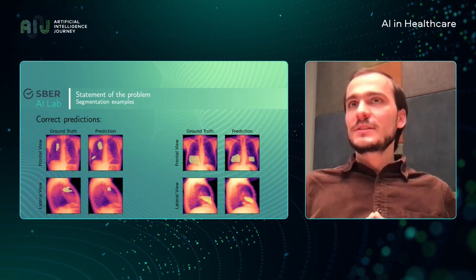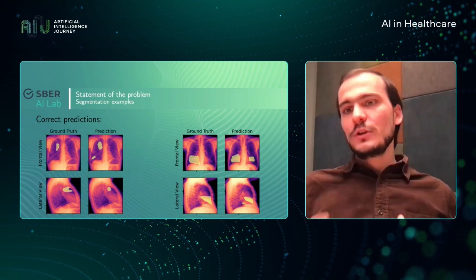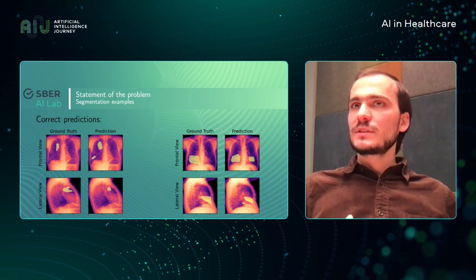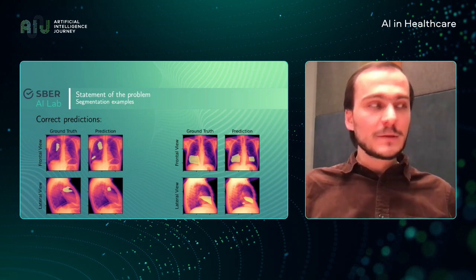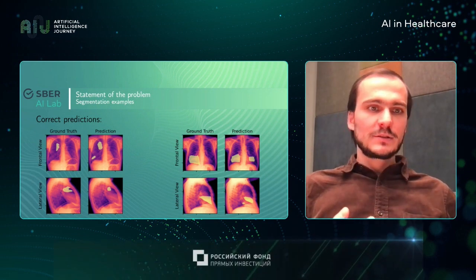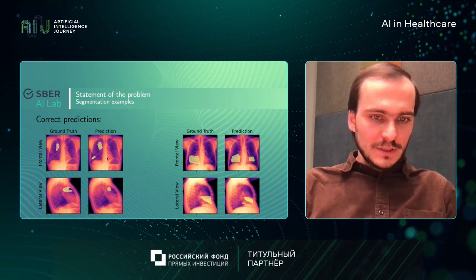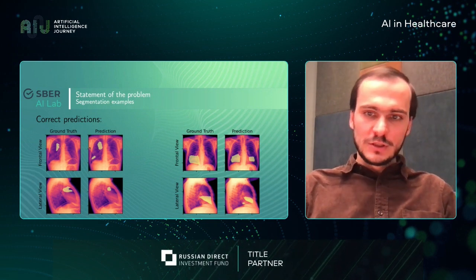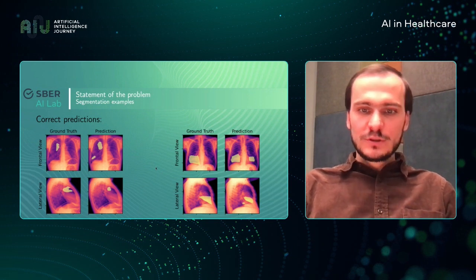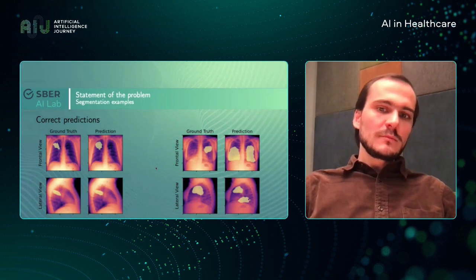From the point of view of machine learning, this is not a very complicated task. Our data set was quite large, fortunately, and we were able to quickly have good segmentation results. And on these slides, we show exactly what the model predicts, and it can be compared with what doctors showed. And we see that in general, the segmentation result is quite good. And this is proved by the metrics we have.